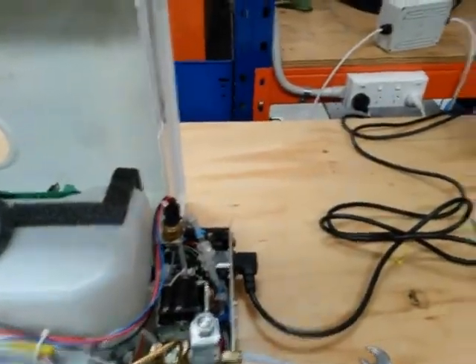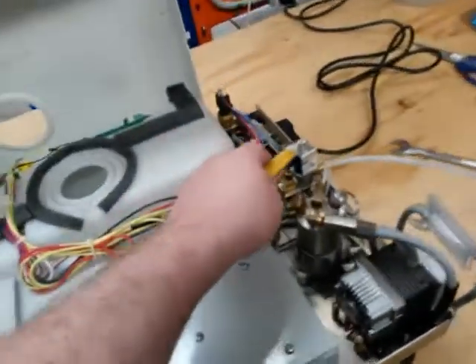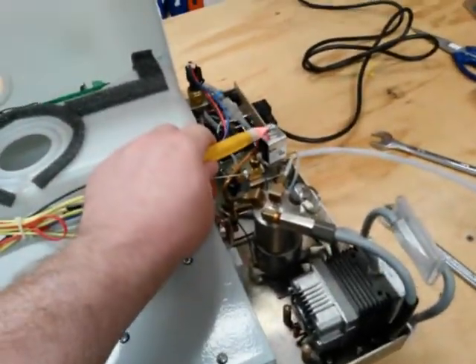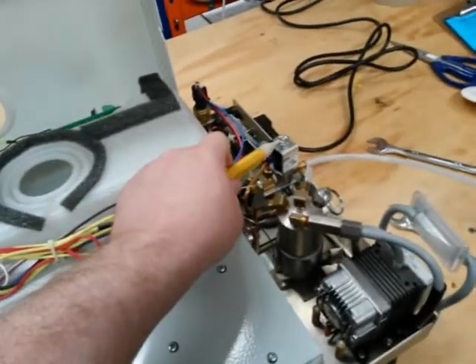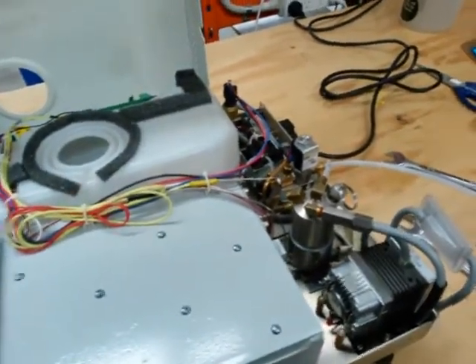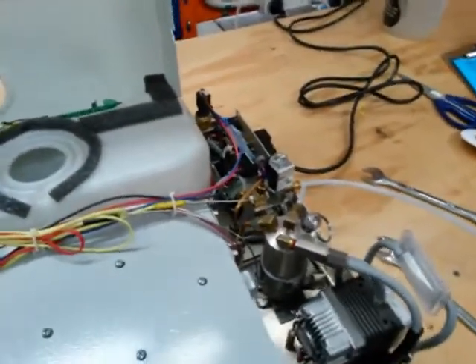We've now got the cover off. The unit is plugged in and switched on, power is on, and the display is connected. I've got a magnetic testing switch — the light is lit up, which tells me we've got power to the coil. So we know the coil is working and the solenoid has power.